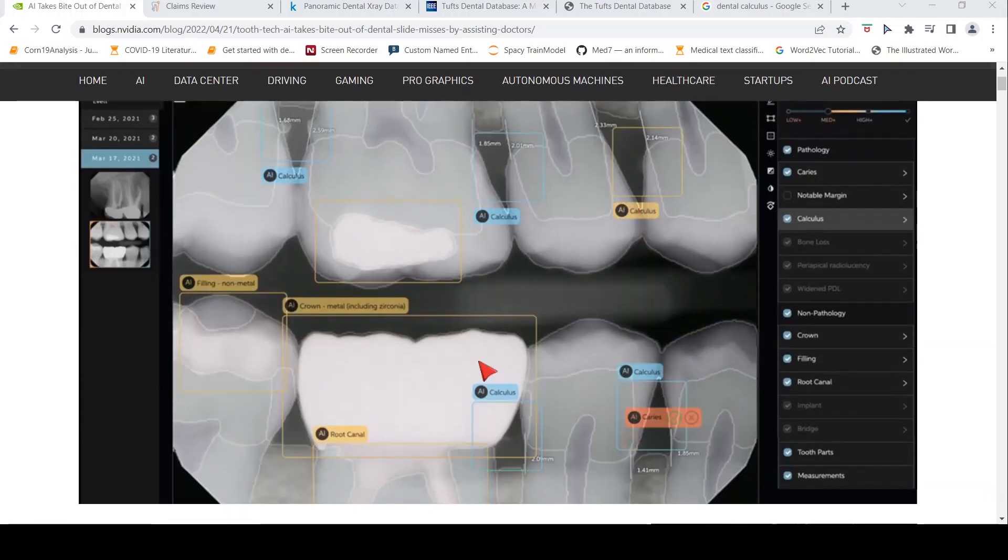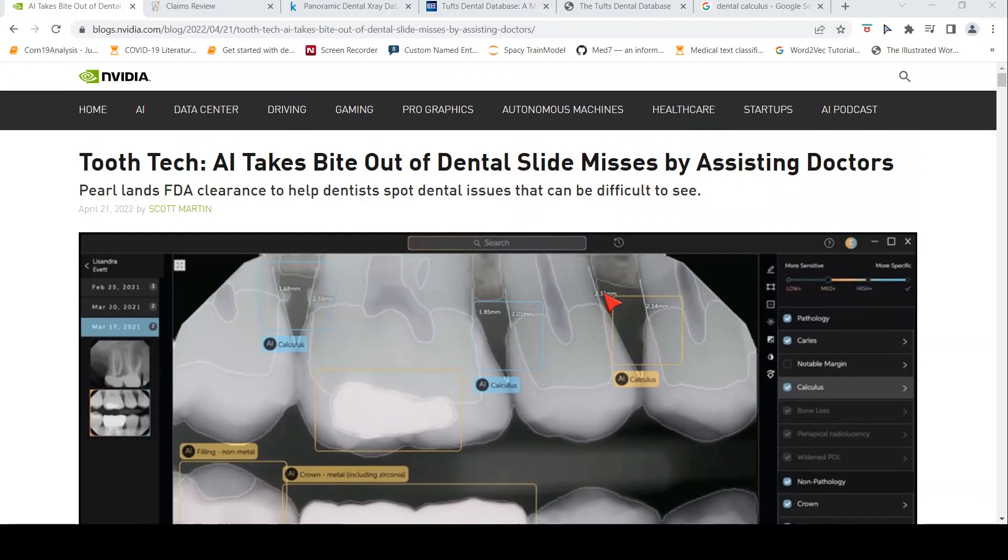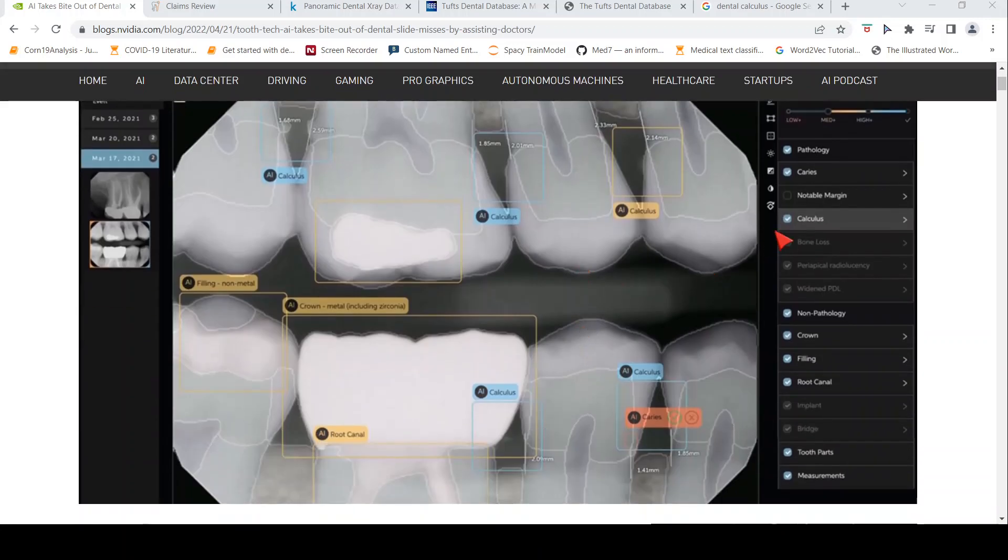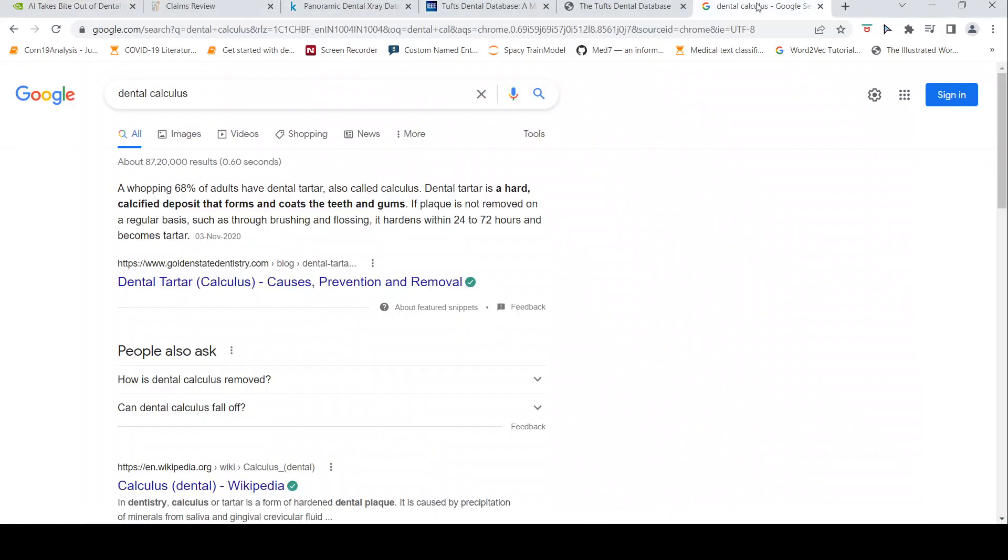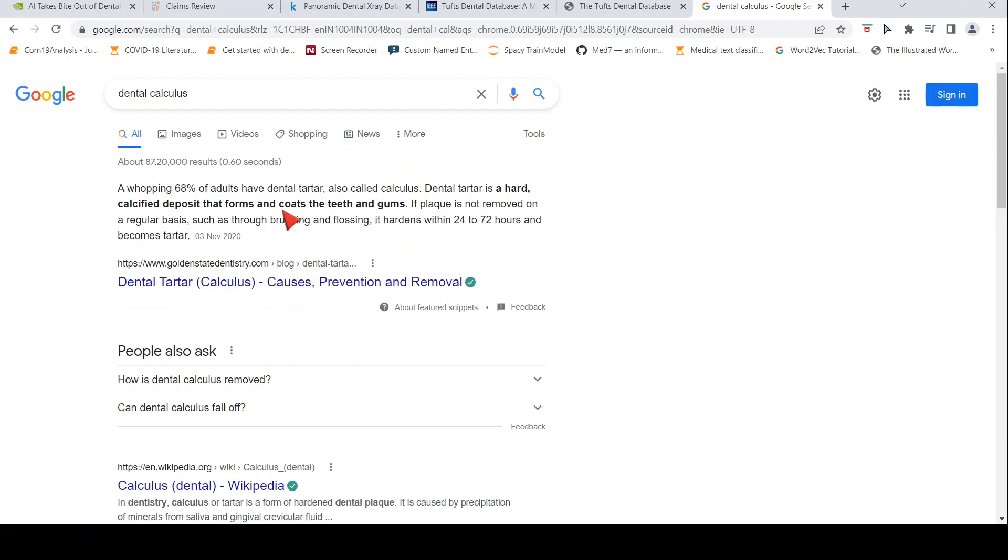This is an x-ray image and this is their application, which can highlight various pathologies like calculus. Now calculus is nothing but a deposit, basically dental tartar or calcified deposit that forms and coats the teeth and gums. If it is not removed on a regular basis, then it hardens.